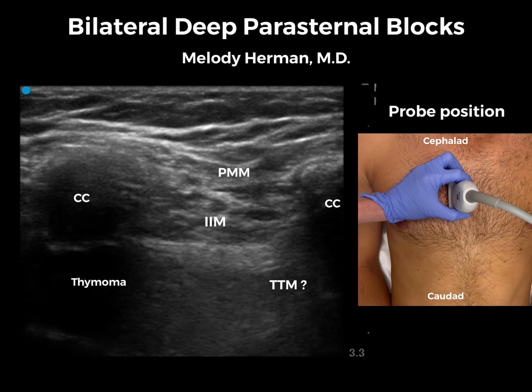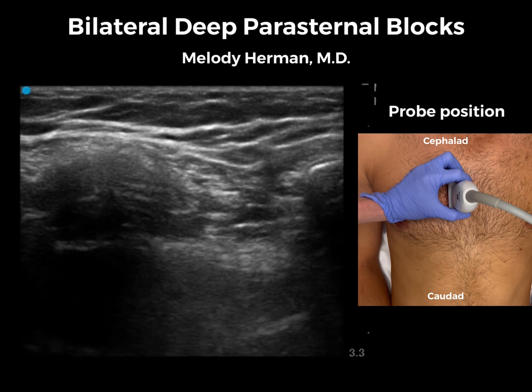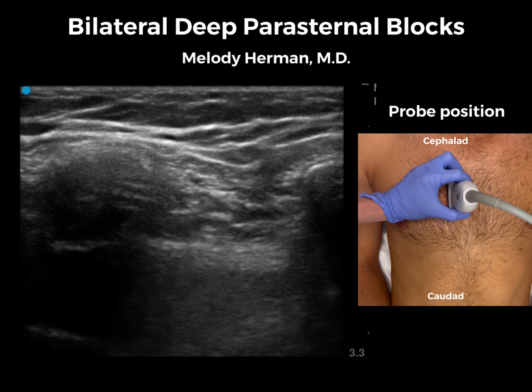I don't see it — that's not unusual because it's really small. And then way down here we have pleura. Usually the pleura is a lot closer; however, in this case it's displaced by the thymoma and there is scarring from the previous excision.